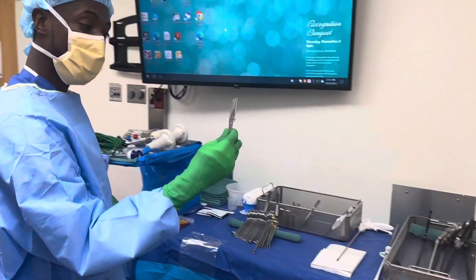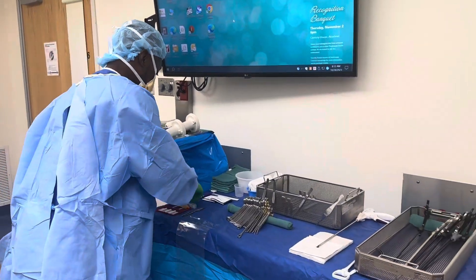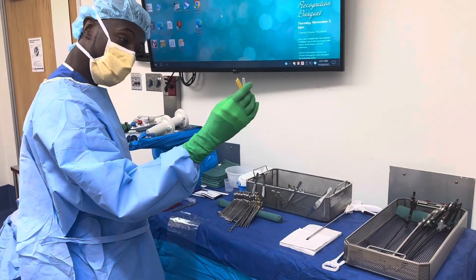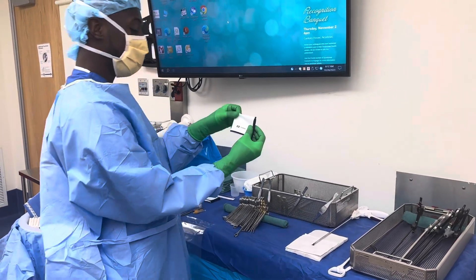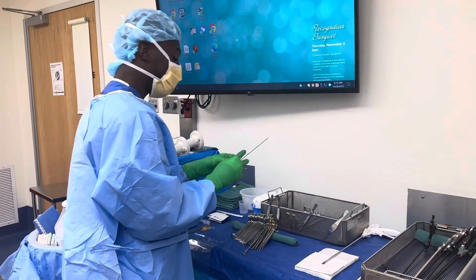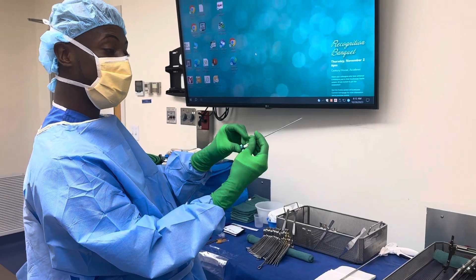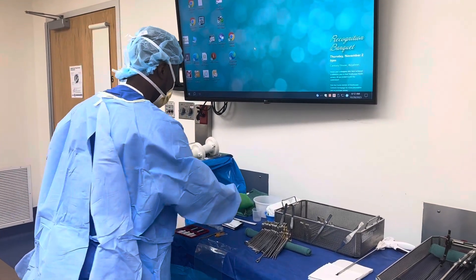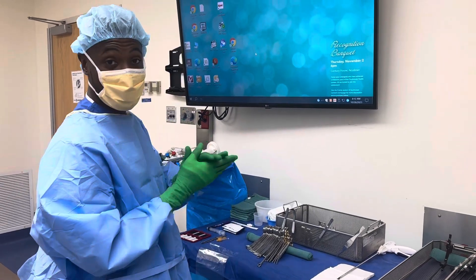Over here we have our knife — 11 blade — we have a syringe that we use for medications, a hypo, this is the cloth that comes with the clear drape. This is a suture passer — we use this at the end of the case to help close the big port that we make with the 12-millimeter trocar. We usually use a Vicryl to do that.